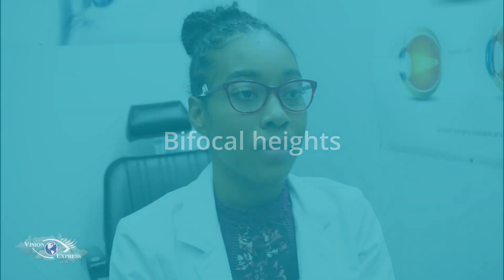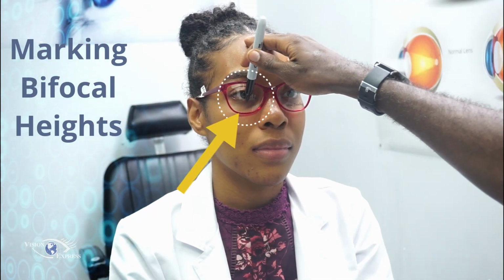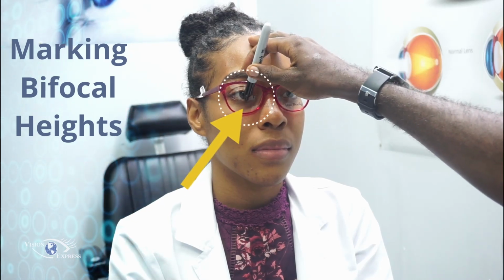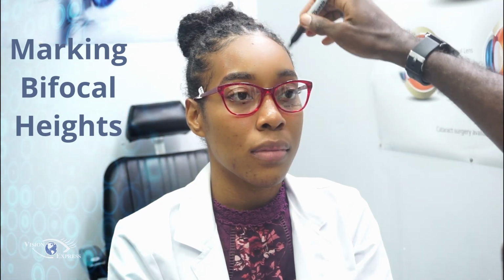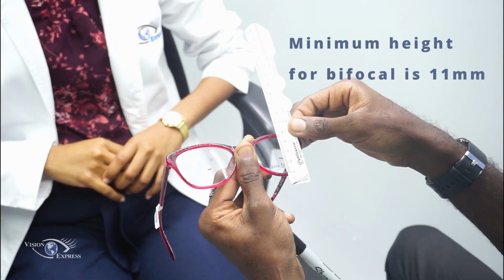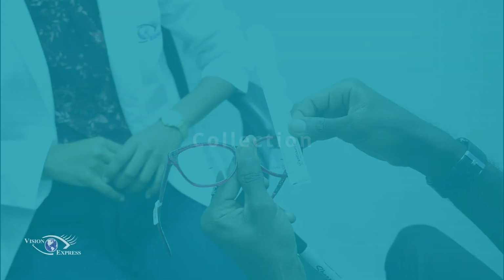Bifocal heights. These heights are taken from the lower lid to the edge of the frame. Again, the patient will look at your left eye while you mark just below the lid. Repeat the same for the right eye. Your minimum height for bifocals should be 11 millimeters.